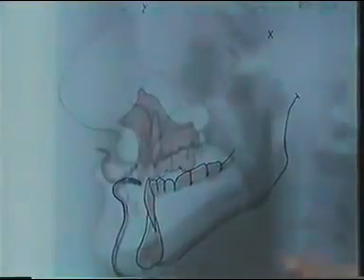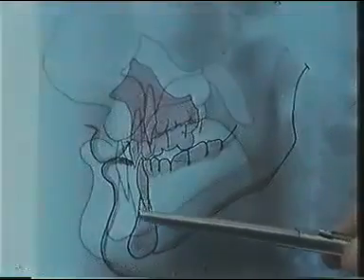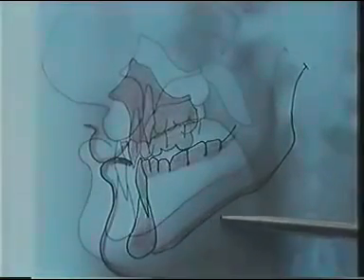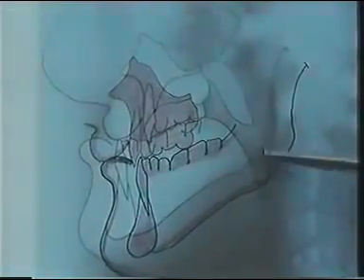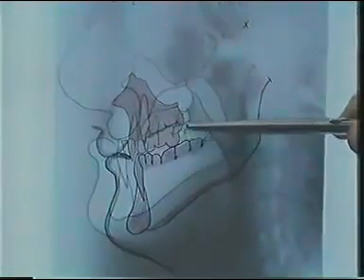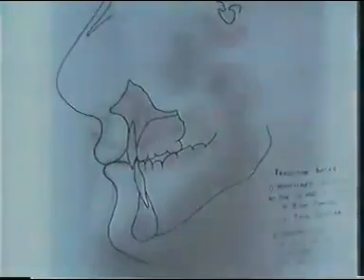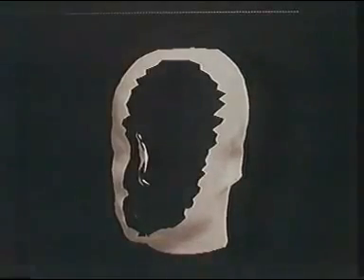This is what's happened. This red outline is where the lower jaw will be in relation to the new position of the upper jaw. This procedure is very difficult because a face is a three-dimensional object and the X-ray is only a flat representation. Nearby at the Slade School of Art, a powerful mini-computer will soon help this process.